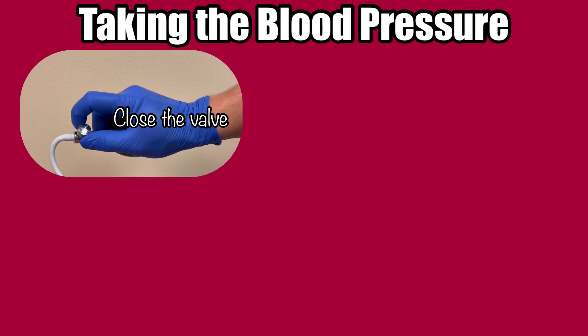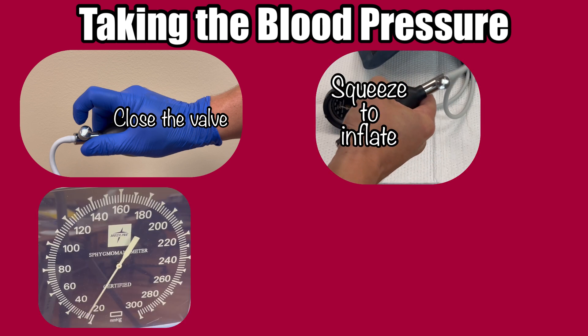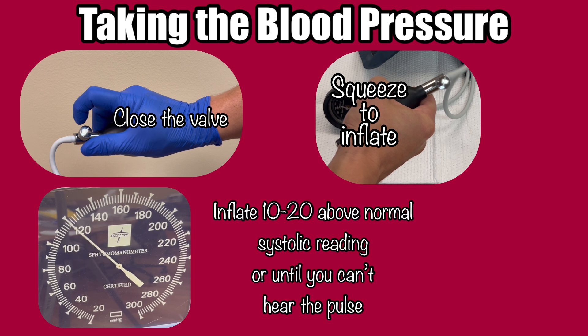Ensure the valve is completely closed by turning the knob all the way clockwise. Now squeeze the bulb repeatedly to begin to inflate the cuff. We want to inflate to a pressure about 10 to 20 above their systolic reading. So if you already know what the patient's pressure is trending — let's say the last measurement was 130 systolic — watch the gauge and pump the cuff to a pressure of 140, then stop and listen. If you can hear the pulse, you'll need to inflate further. Go up another 10 and listen again. Once you don't hear the pulse any longer, you can begin to slowly deflate the cuff. If you don't know what the patient's normal pressure is, pump up to 130 to start. If you don't hear anything, stop. If you still hear the pulse, continue adding pressure until you stop hearing the pulse.